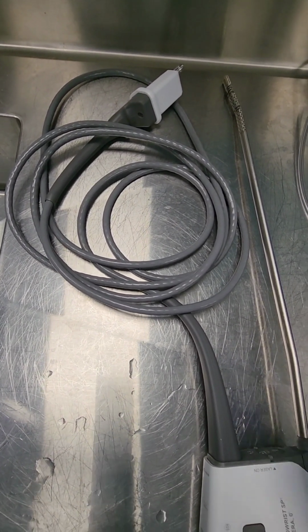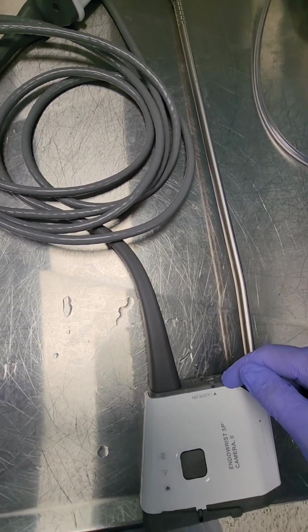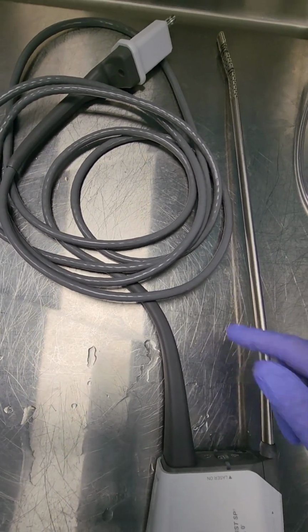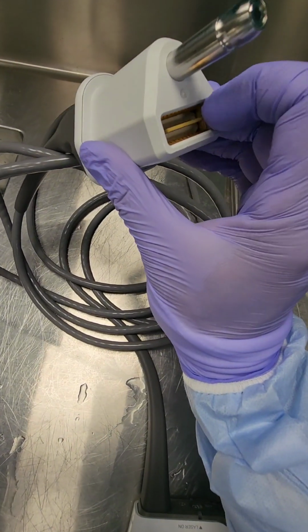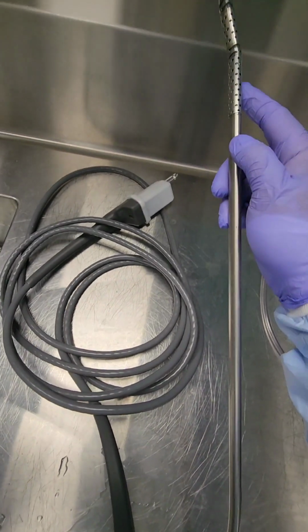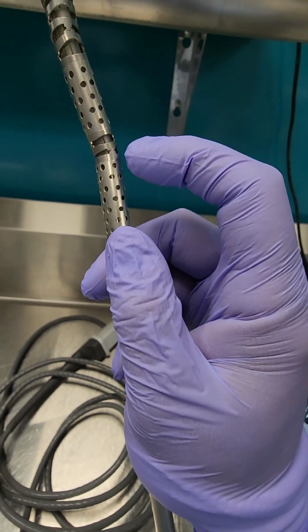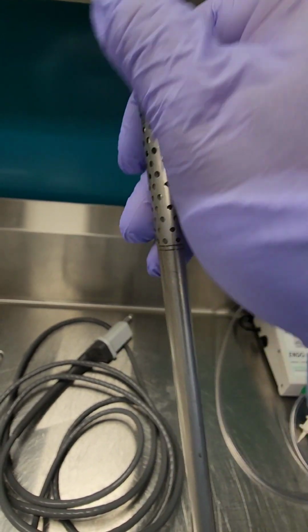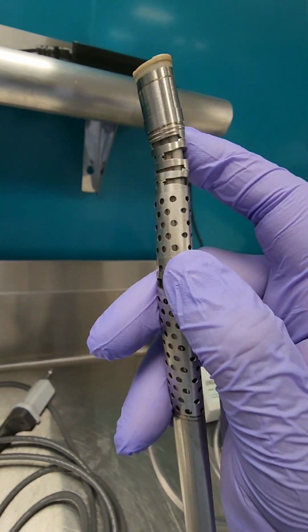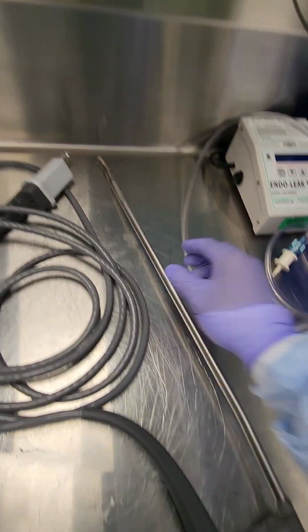You want to wipe down and use a soft bristled brush to get to the hard areas, but never brushing the distal tip glass section of the device. Always be careful with that. You want to make sure that you're brushing the connectors, but never the distal tip or the glass portion of that scope. You want to pay special attention to the gaps and the joints in what's called the elbow and the wrist, as well as the dead spaces and the perforation there.